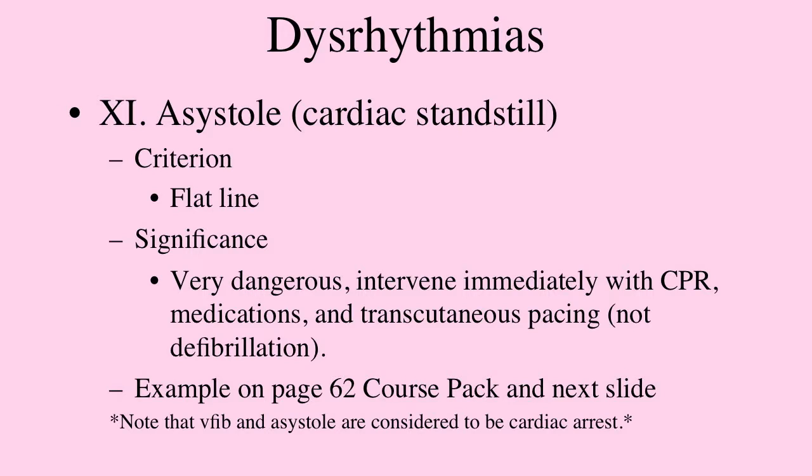And you do not attempt with defibrillation, but you make the attempt with CPR, medications, and external pacing with a person. On page 62, it shows an example, basically a flat line. So if you get that on an exam, you see a flat line, that's asystole. And again, it's considered to be cardiac standstill in a very bad situation. So VFib and asystole, as shown on the slide, are considered to be cardiac arrest.